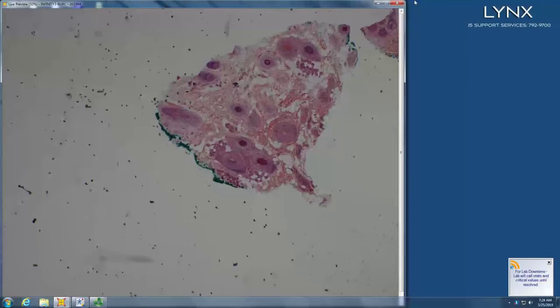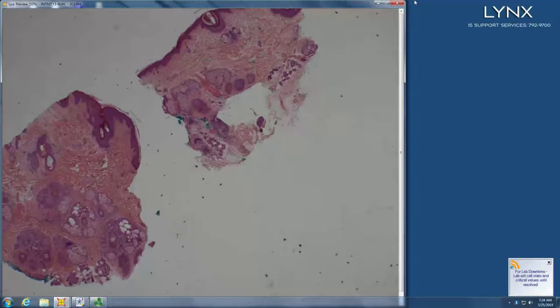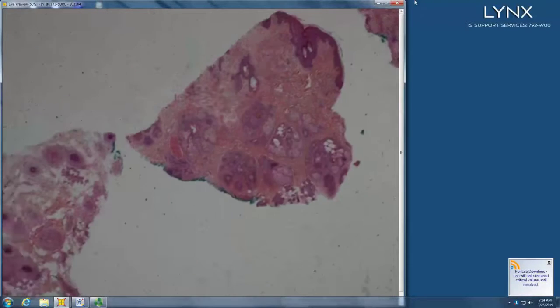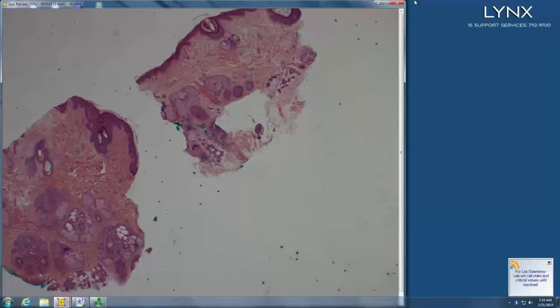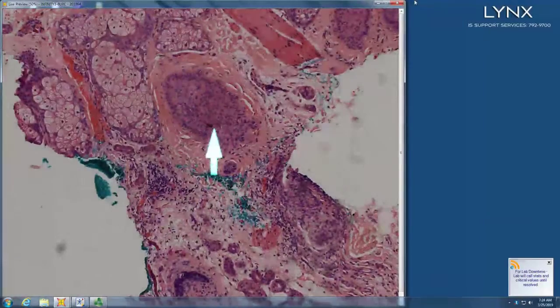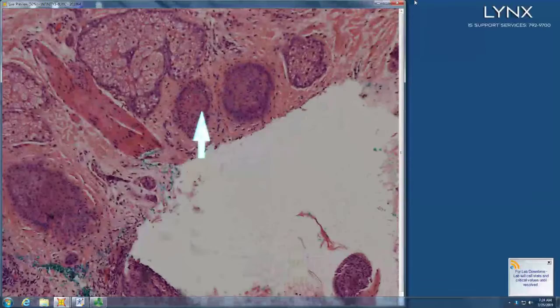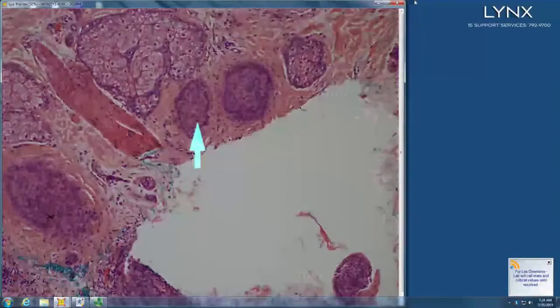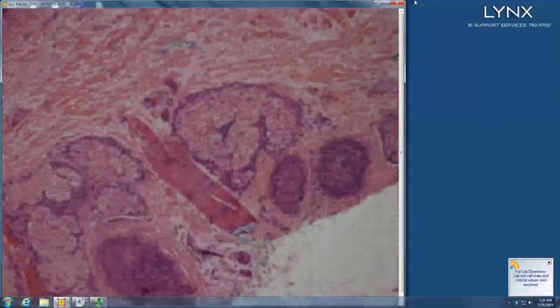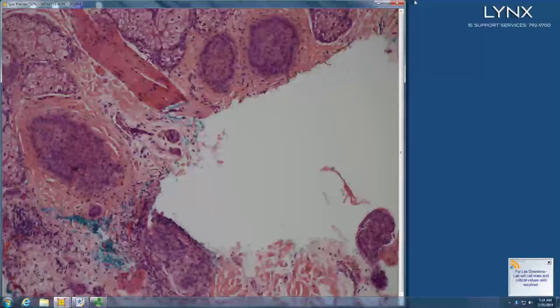So if it's cut both vertical and transverse, what were they probably looking for? Alopecia. So they're looking for an alopecia. And then what kind of hair is that, with necrotic, dead red keratinocytes in it? Catagen. So there's a catagen shift. So give me a differential for multiple catagen hairs.